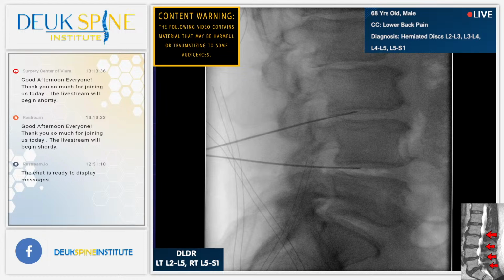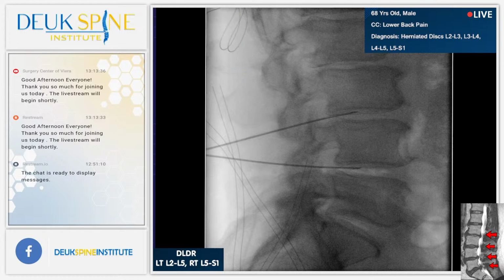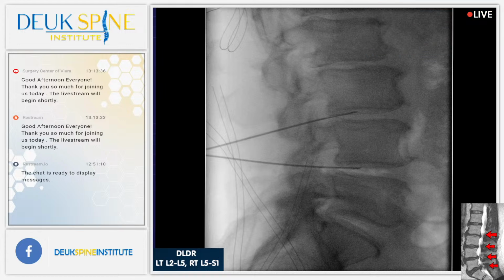So the captain used a tool called the sextant to navigate. We're using a fluoro, but it's not the fluoro that we're navigating off of. We're navigating off the spine. So we actually use the spine structure to figure out where to go and how to get there. Just like a sextant would use stars as the physical points, we use the spine as physical points. But we use the fluoro to find them.